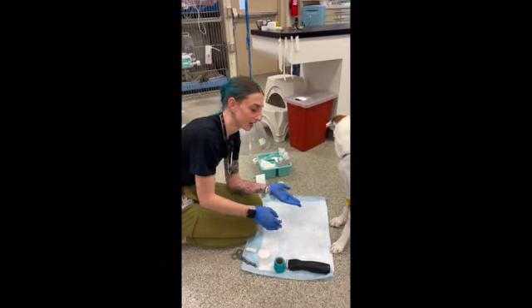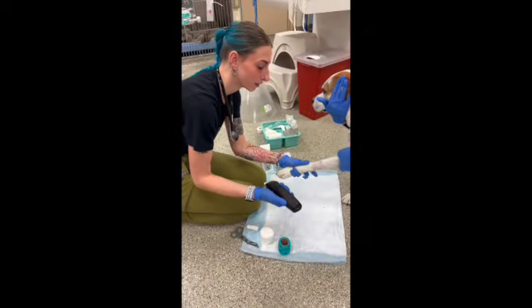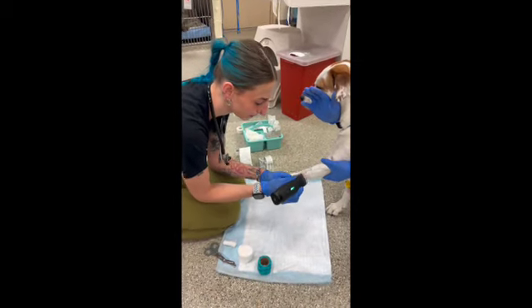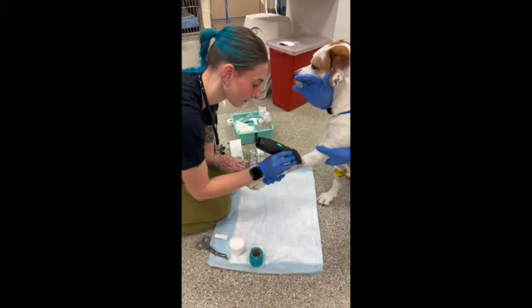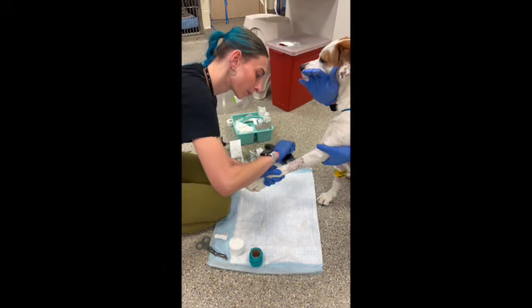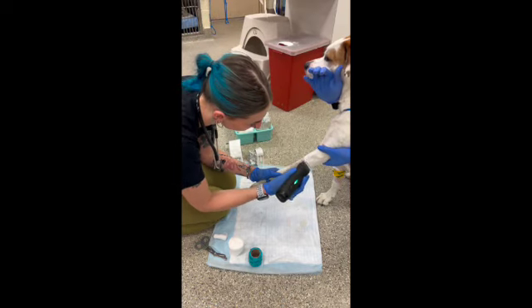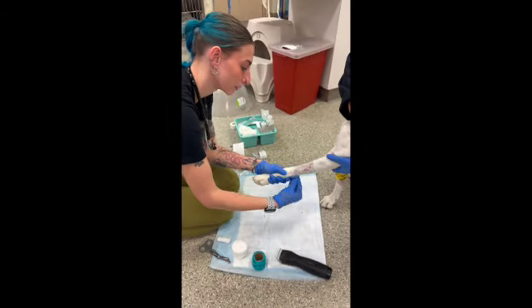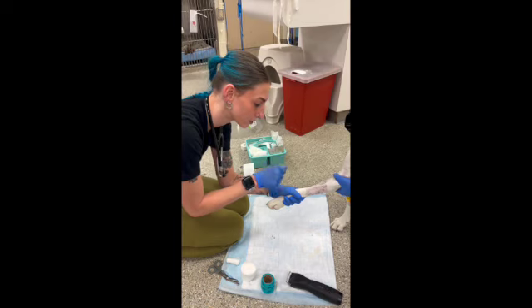So we're just going to place a new catheter in the other limb. I have my coworker here that's already holding for me. I'm just going to clip some more fur because it looks like some of the fur has grown back since her last placement. So at our hospital, we clip circumferentially just to help our tape stick to the patient better.